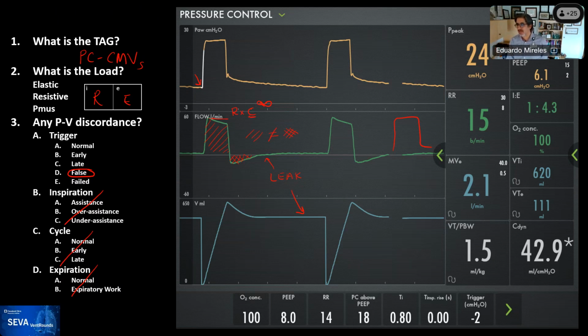Have no fear. This is not an easy one. So put your thoughts. What would you trust? Somebody says, can you trust any? It's good when you ask me a question. Somebody said in between, none, neither. Rob, what are your thoughts here?